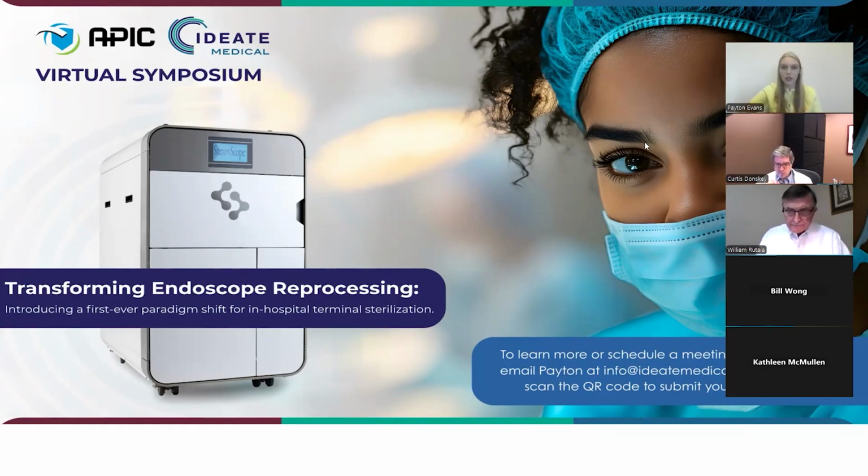Thank you. Do the scopes need to be stored in the reprocessing department, or can they be brought to other departments until use? I guess I can take that one. They're already in a sterile container, so they can be stored in any department or any location that's appropriate, as long as you don't crack the lid. I'd just add in, that'd be something to definitely discuss with your IP department, to ensure we're following AAMI guidelines, et cetera, for storage of sterilized items.